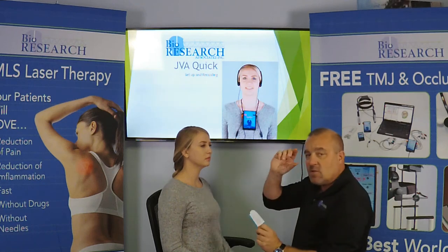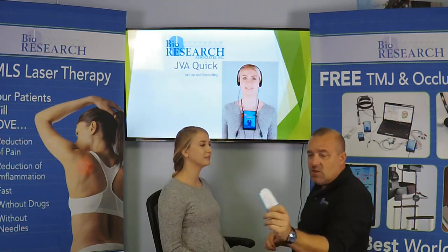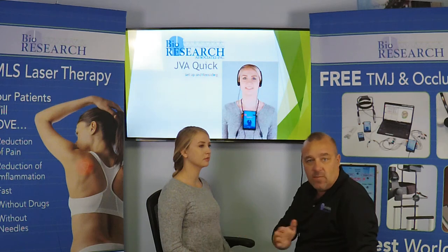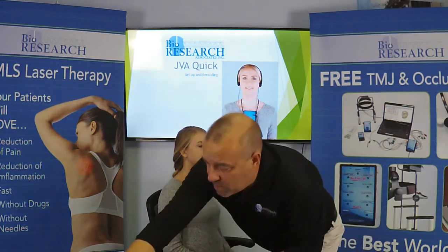But if they have a shorter range of motion, what you can do is take your range of motion card, hold it right along the midline and have the patient open wide. Yeah, and she opens perfectly straight. So the lateral deflection, again, the position at maximum opening, for her is 0, but it could be some number of millimeters left and right. Unfortunately, without a jaw tracker, you have to estimate this number. So I'll put 0.